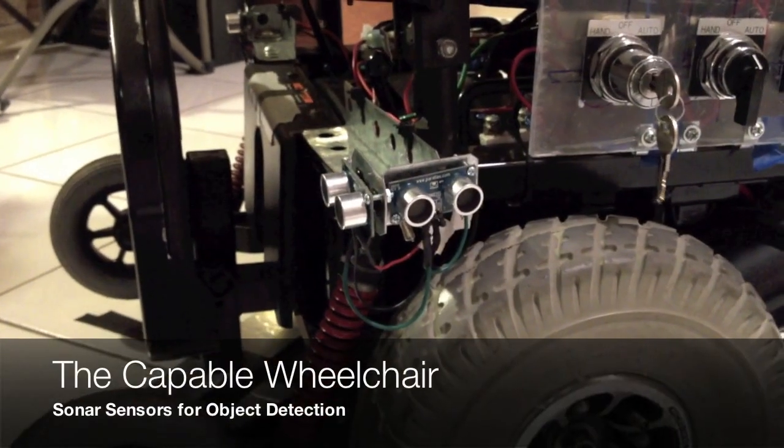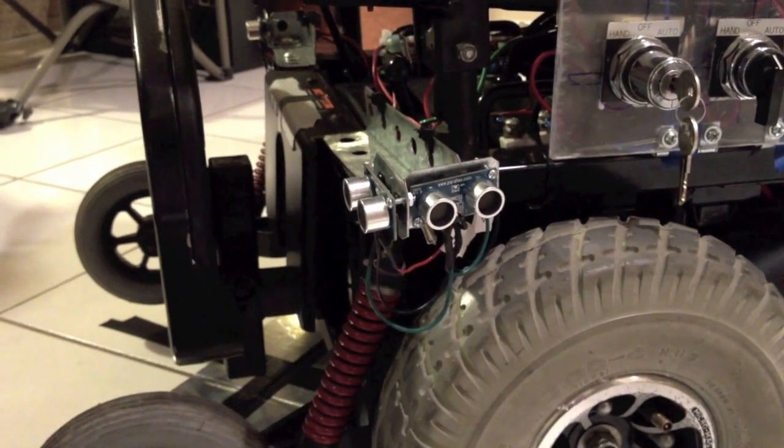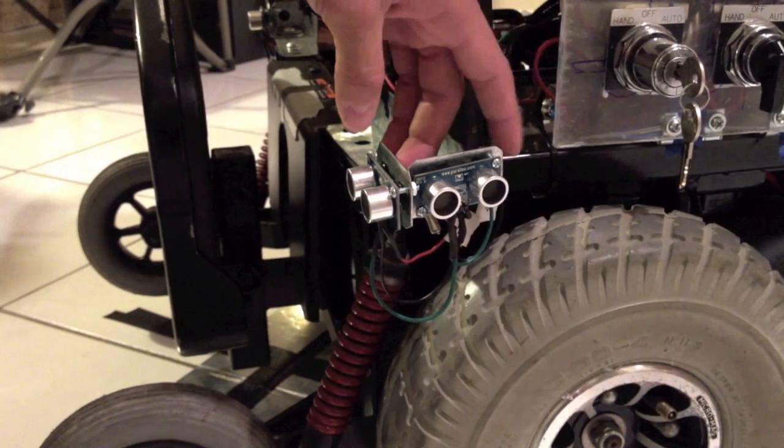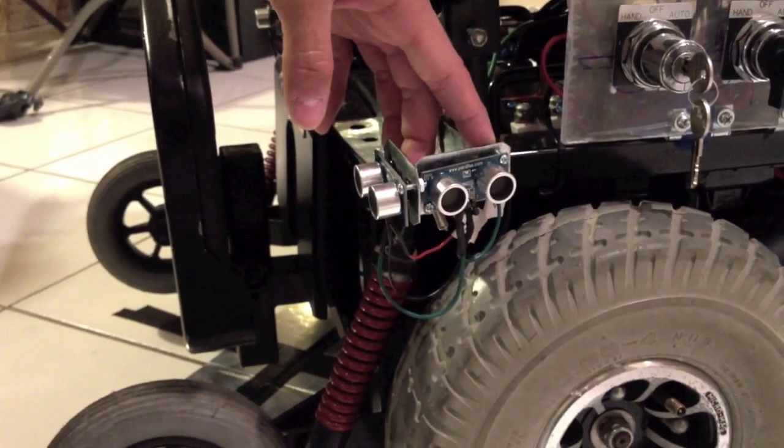As a safety measure for the wheelchair to prevent obstacle collision, we added sonar sensors. These sonar sensors enable us to detect objects that approach the wheelchair when the wheelchair is moving along its path.